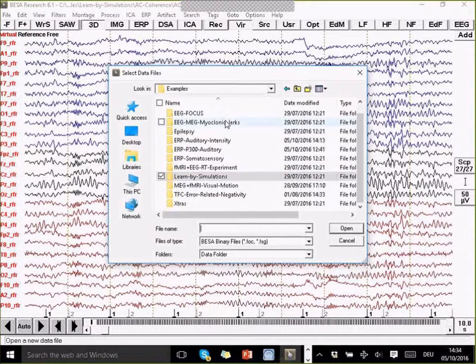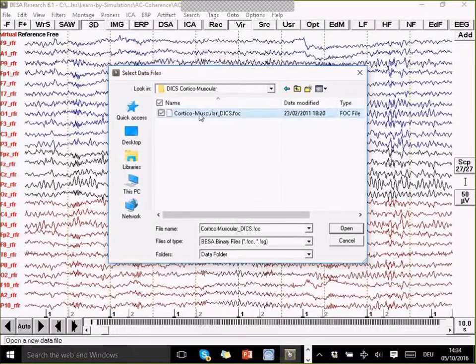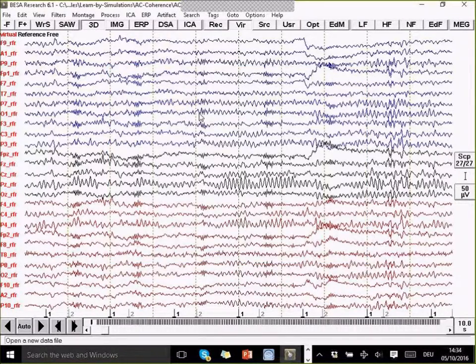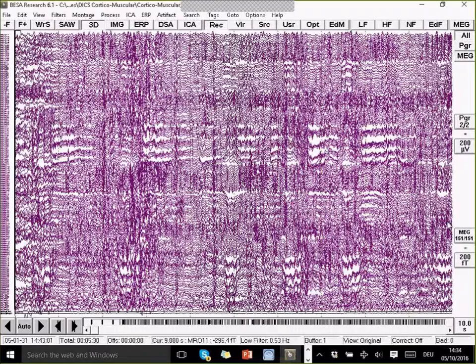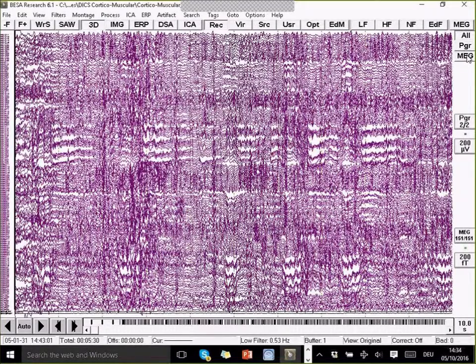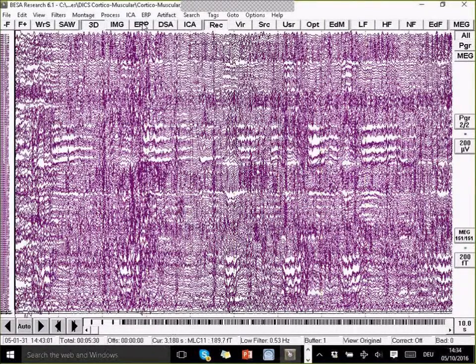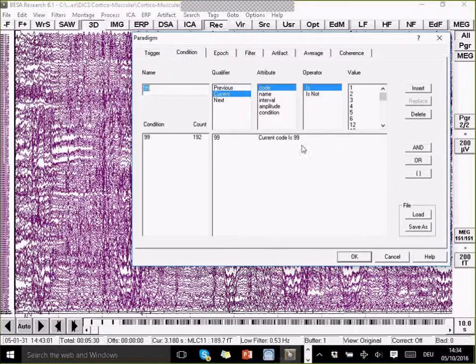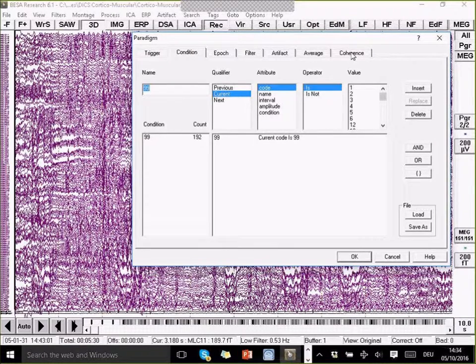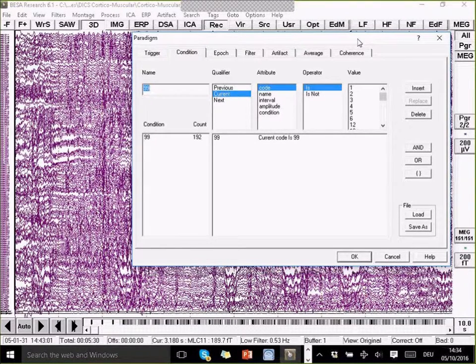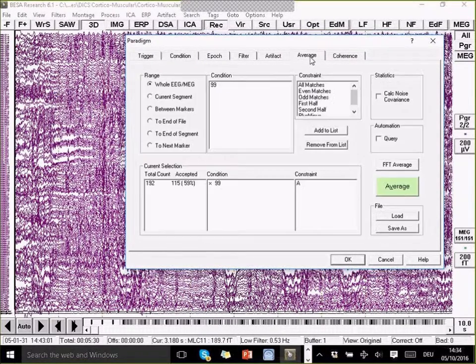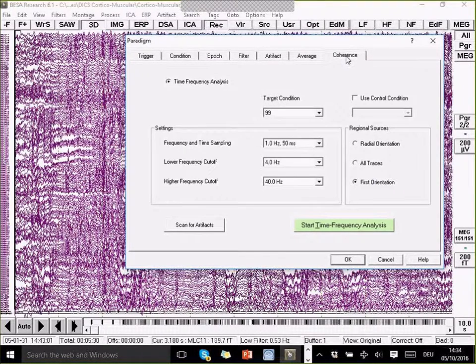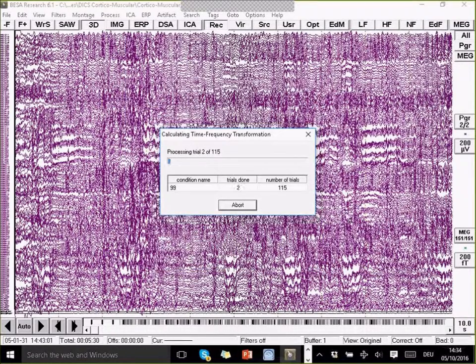I'm going to open a data set that's an MEG data set now. Also in our standard example data set, DICS corticomuscular. Here we have a MEG recording with 151 actual gradiometer channels. I'm just going to run the time-frequency. What was done is that a subject needed to exert a force against the lever with one of the arms, I think left arm, and then had to try and keep the force steady over some time. We've now got, we've inserted triggers during this time when the force was applied.